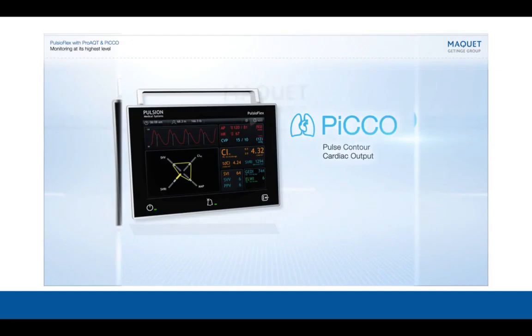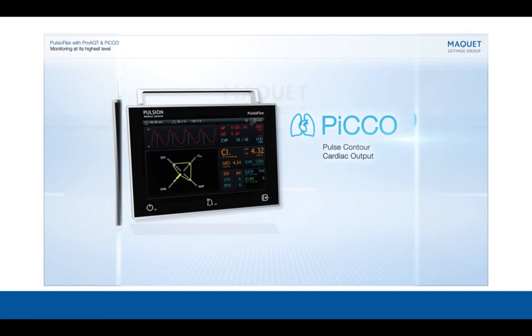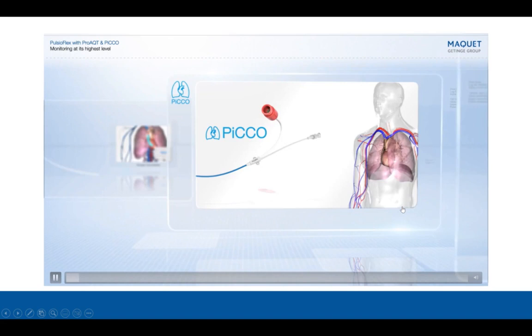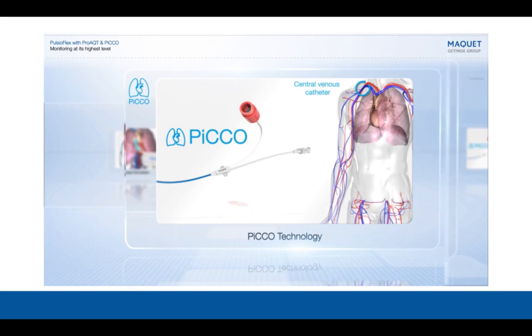So just to remind you, with the PiCCO system or the transpulmonary thermodilution method, let's just watch this video. In order to use PiCCO, a dedicated catheter is needed, which can be inserted into the brachial, axillary, or femoral artery. In addition, a standard central venous catheter is required.